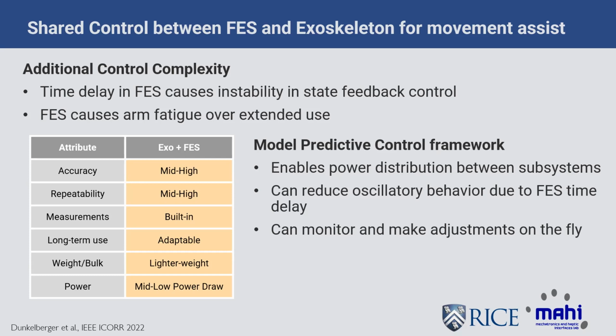It can reduce oscillatory behavior due to the FES time delay by looking more towards the future than looking at only the current state and time. And we can monitor and make adjustments on the fly, hopefully compensating for fatigue.